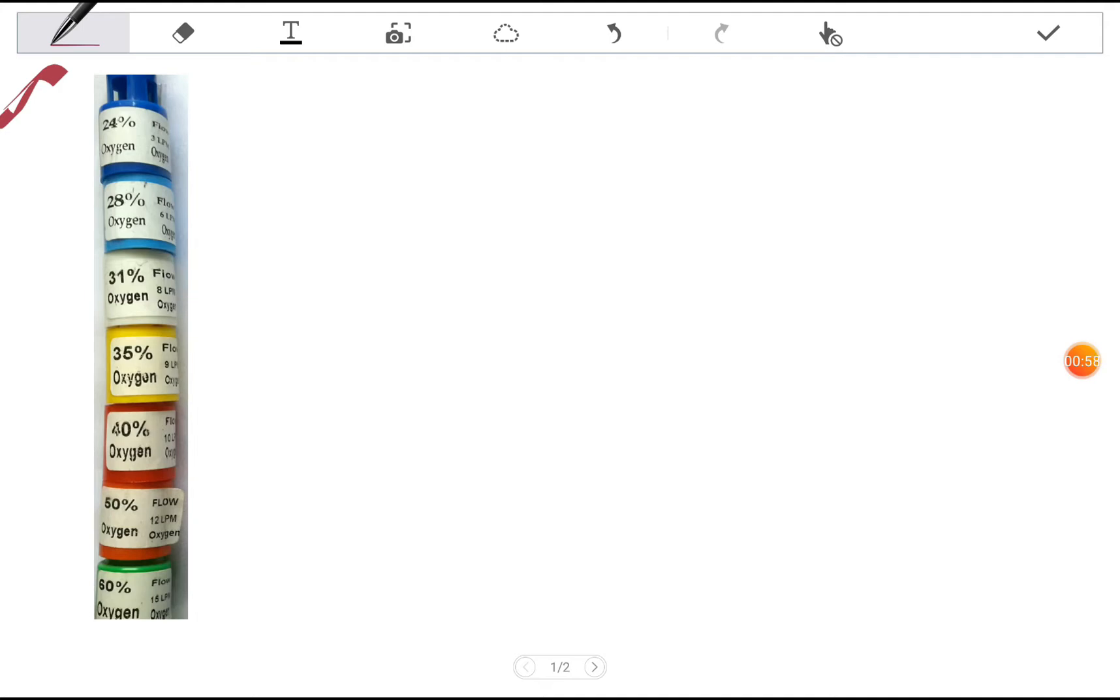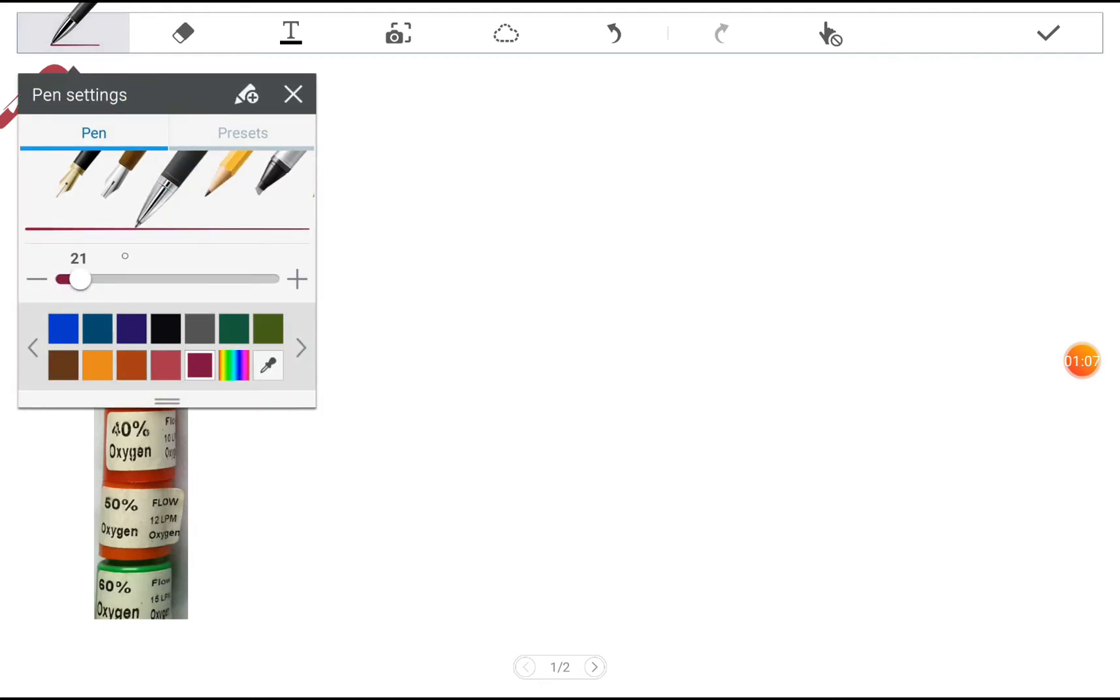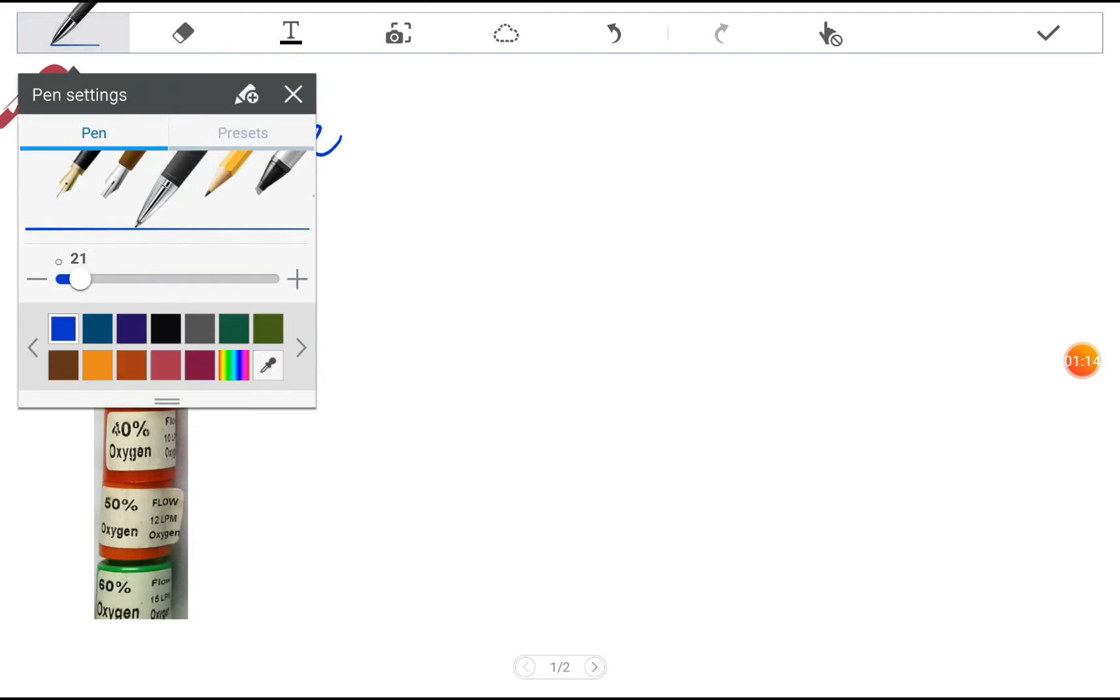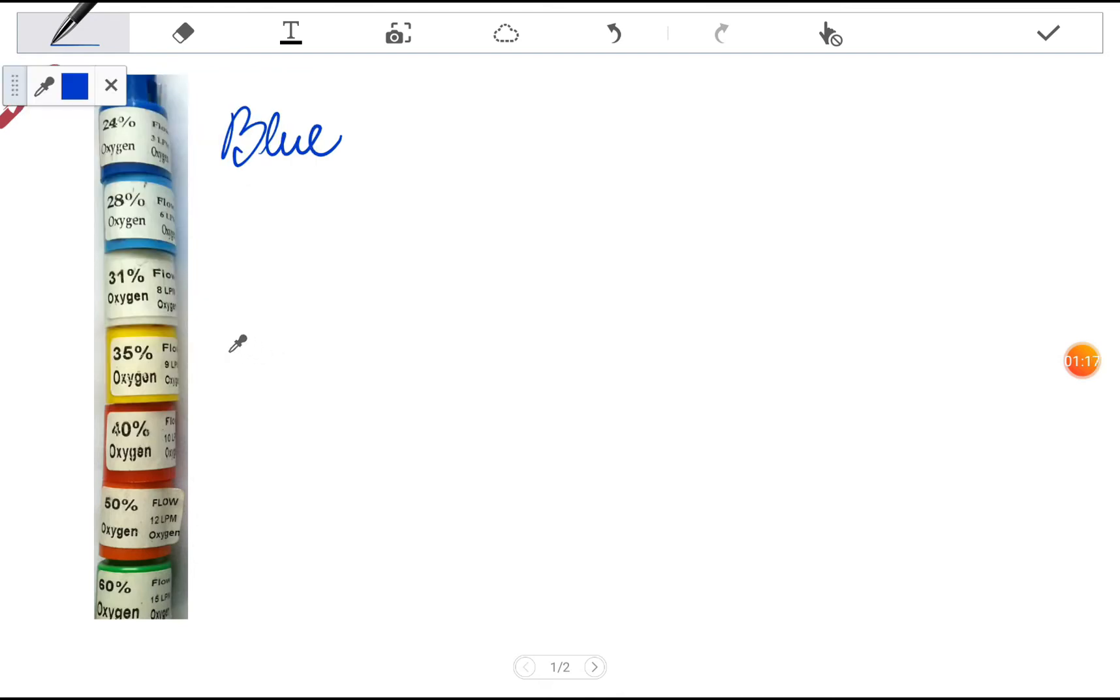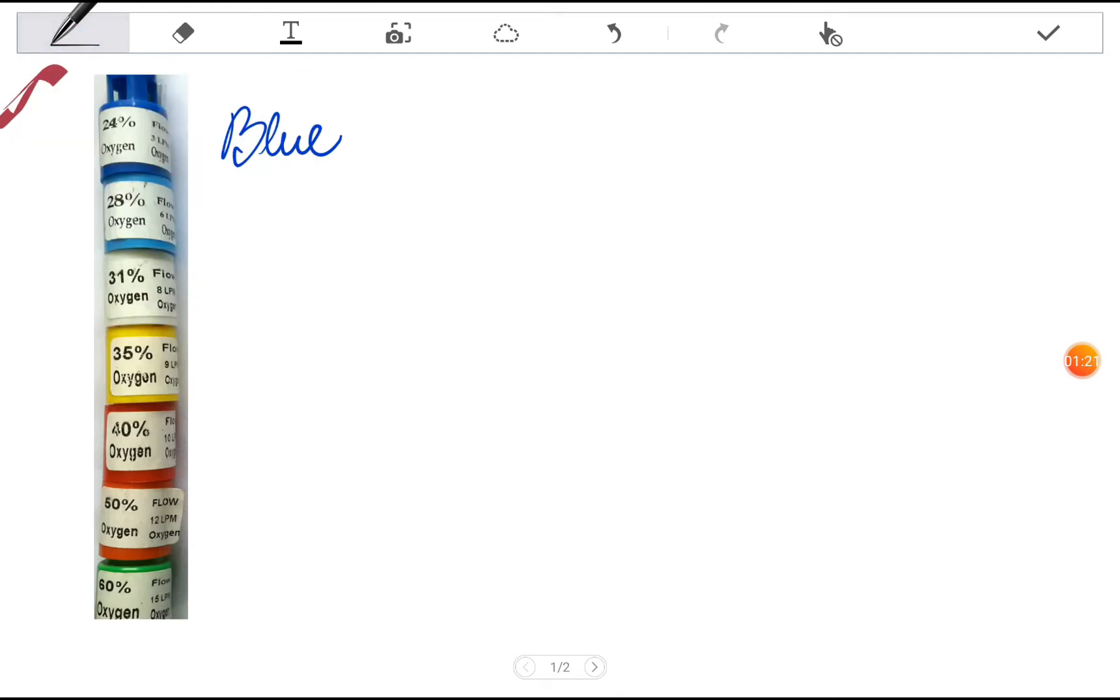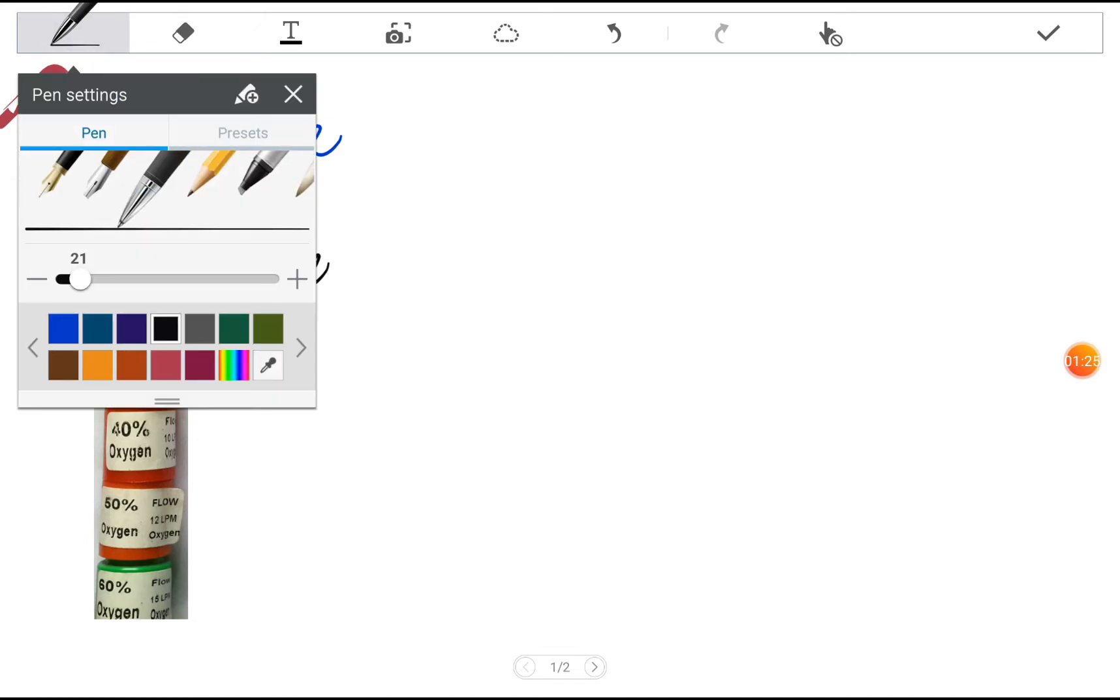Now it becomes very difficult to remember them in sequence and their flow rates in sequence. So we'll mention all the colors below. First one is blue, then we come to white, and then yellow.